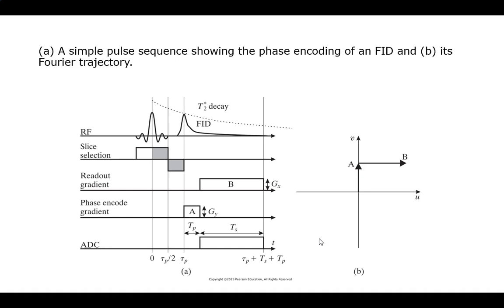So you can now see for this one where it shifts. And again, this is just going to be your kick for up. So we have this second time period we have to do to get me into my shifted baseline to be able to read them out. Okay.